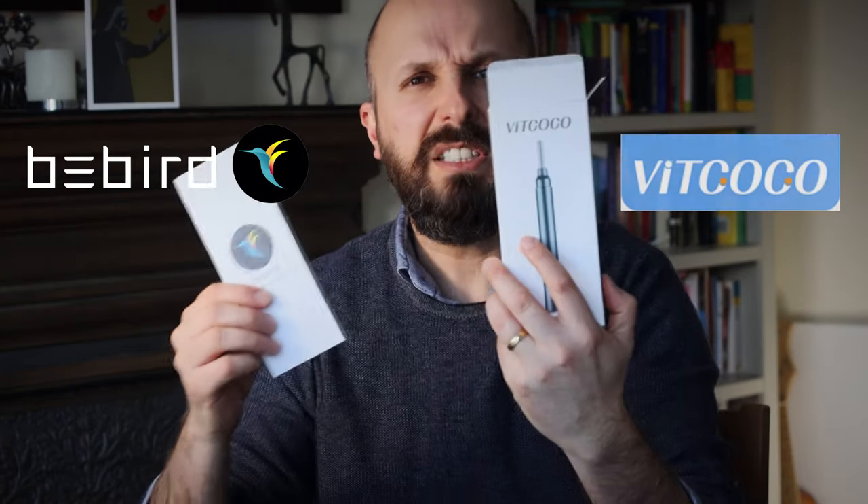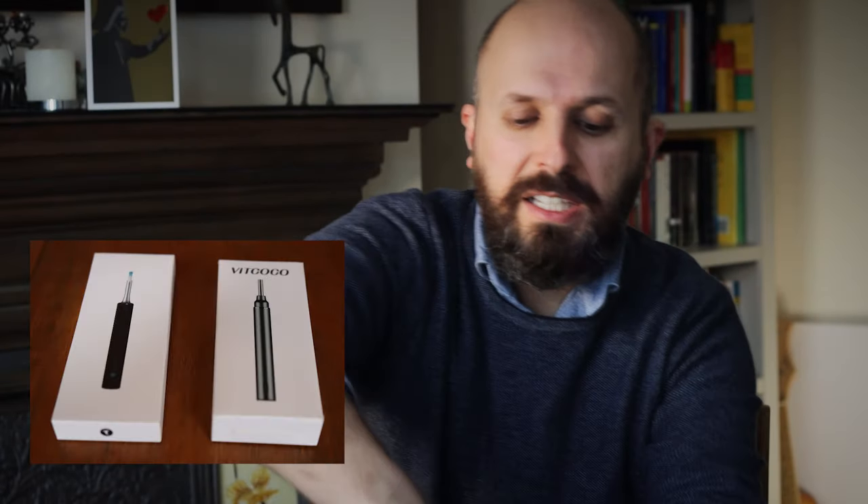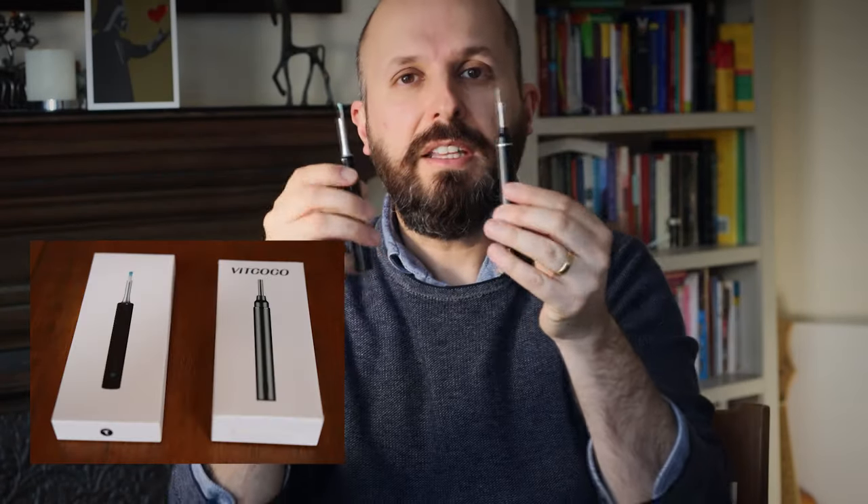Hi there, my name is Vic Veer. I'm an ENT Consultant Surgeon working for the National Health Service in England. Today I want to tell you about two devices which have been brought to my attention, which help people clean out wax from your ear. The first is a product called BeBird, the second one is Vitcoco. I'm not sure why they're called those names, but they look a little bit like this.